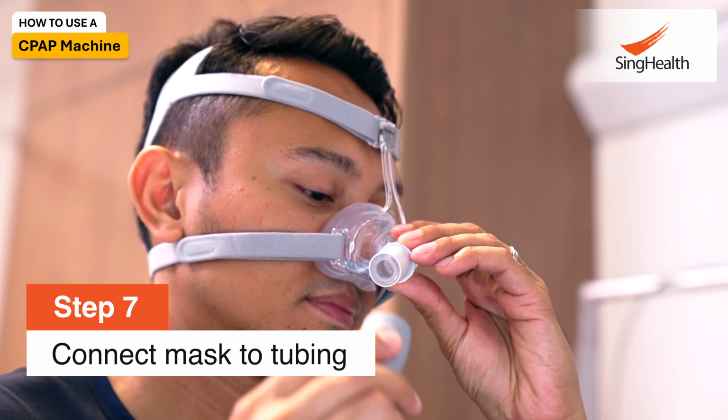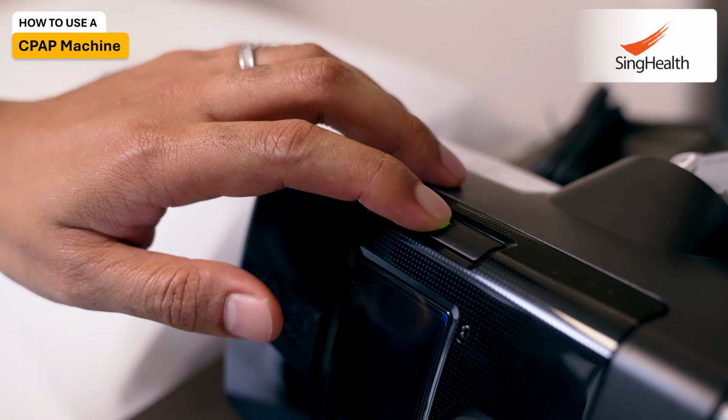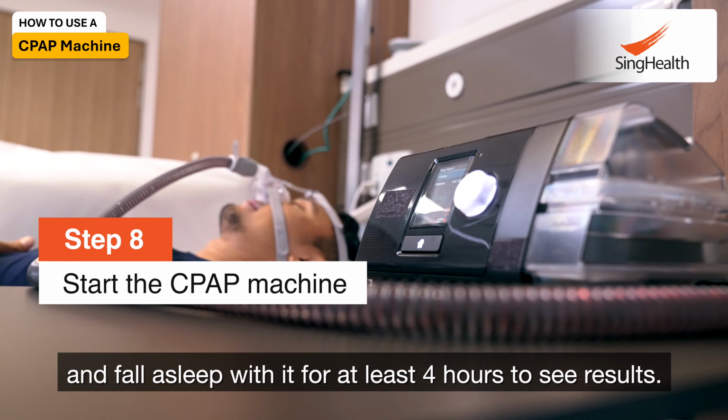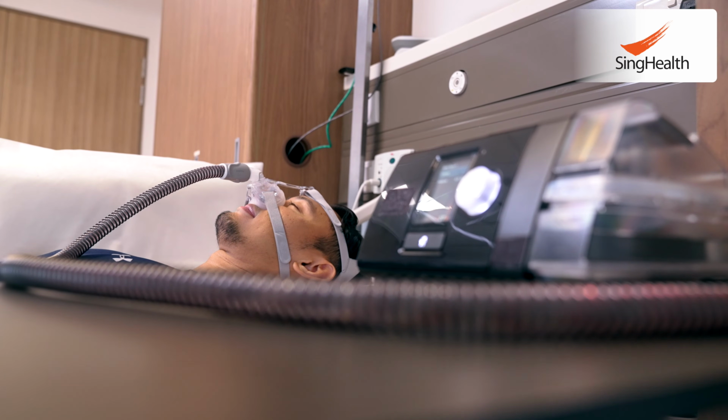Step 7. Connect the mask to the tubing. Step 8. Switch on the CPAP machine and fall asleep with it for at least 4 hours to see results. Also, remember to tighten the mask to ensure no leakage. Good night!